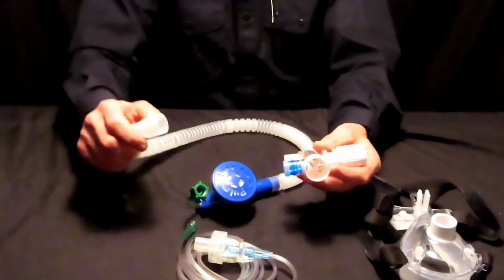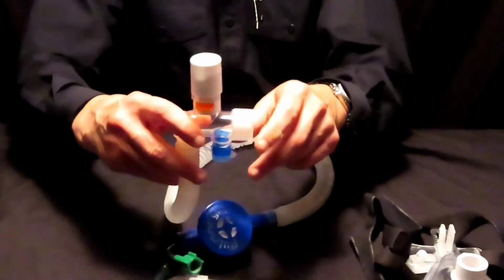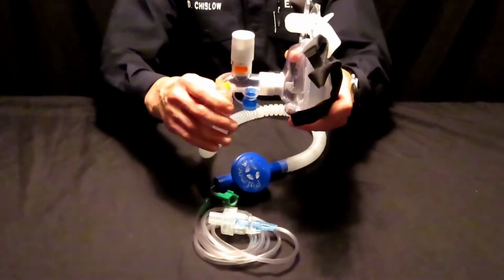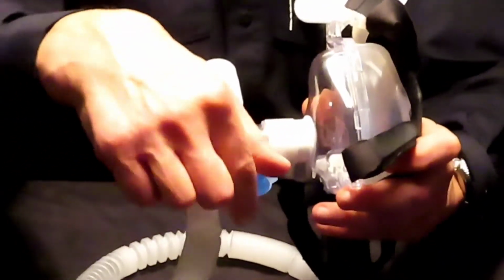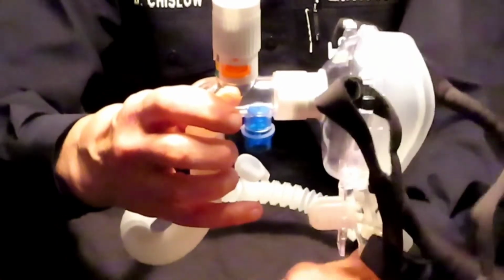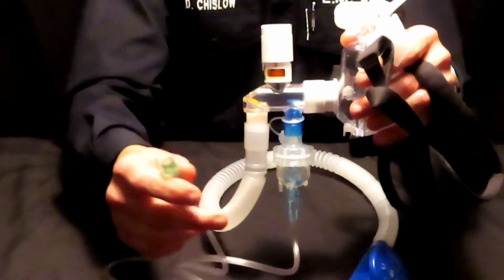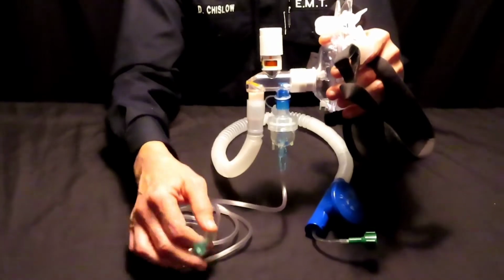The opposite end of the corrugated hose is inserted into the PEEP valve, as I'm showing, and then the PEEP valve is connected to the CPAP mask. If nebulization is required, there is a T connector on this PEEP valve just below, which I'm going to expose here. And then the nebulizing connector can be inserted, as I'm showing. The other end of the nebulizer hose is attached to the barb connector on the oxygen tank regulator.